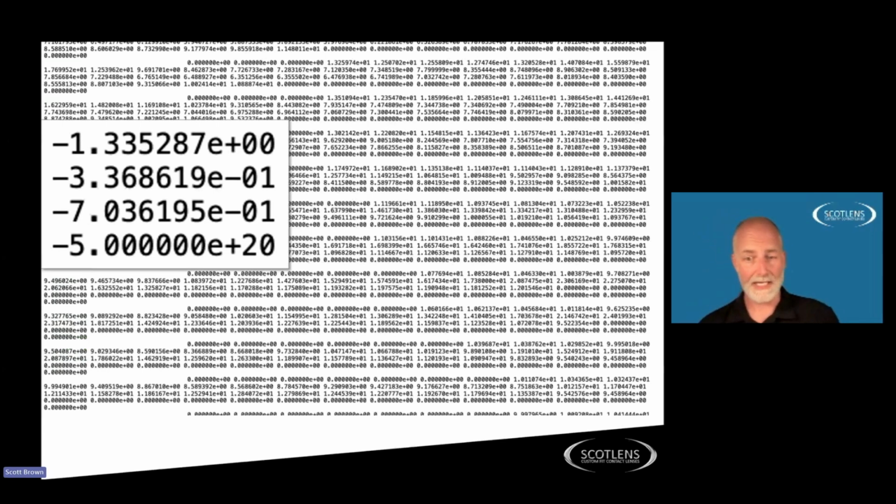Now, a bit of insight from me as a lab, because this is what a topography is. Effectively, when we get sent or we export a topography and the raw information from a topographer, this is the information we get. Now, this is nothing more than a coordinate and a height. So we see the raw data.